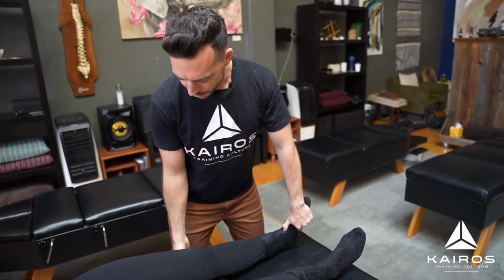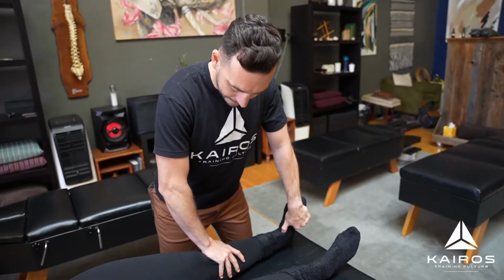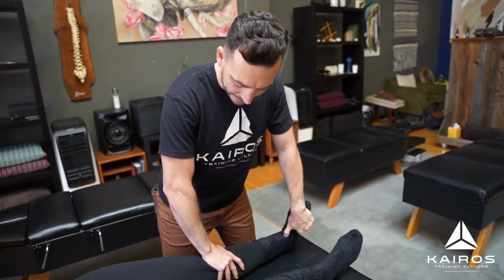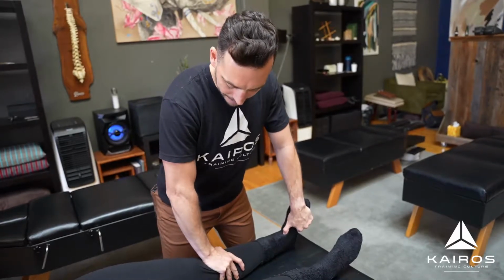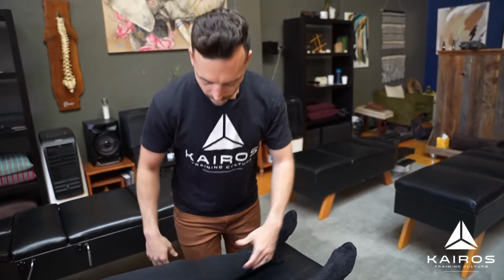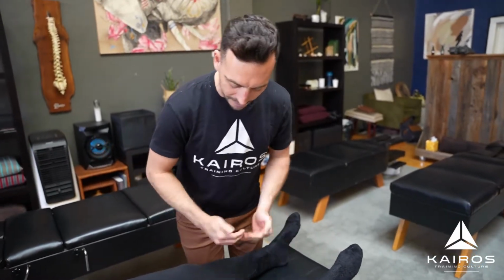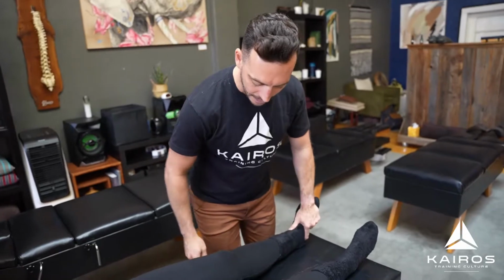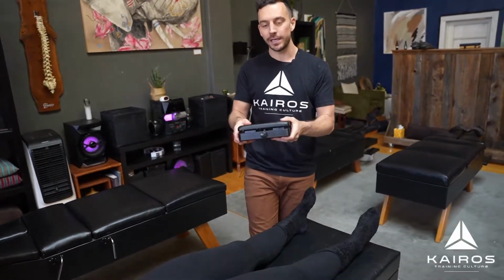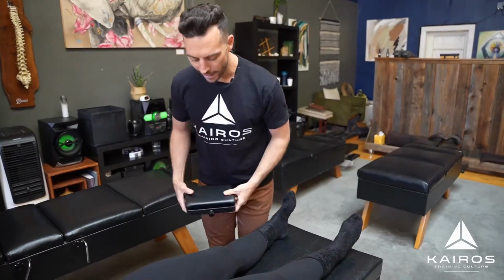I'll keep them in that position, prop it up again, and continue to get some movement within the tibia as I guide it into internal rotation and down along that joint line. So it used to be with other types of versions like this that you had to line it up perfectly, but because it opens up throughout the entire width of the piece, then it's really easy to use. So that's an awesome way I like to do that.